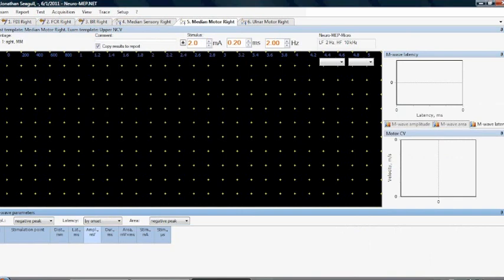It's showing me here stimulation point, distance, latency, amplitude, duration, area, stim, and you don't have to have them all. You can go again to setup, change, nerve conductions, and the default template for sensory or motor. You could choose which one you want to see. You might not want to see the duration or the area, so you can choose that, and then you have to save and load the new setting.